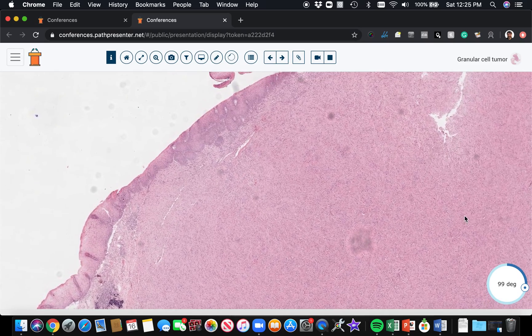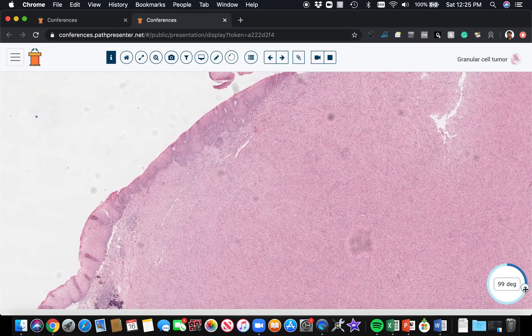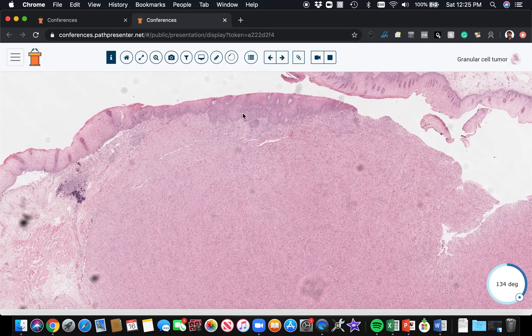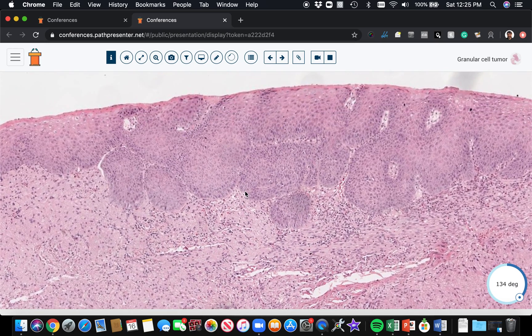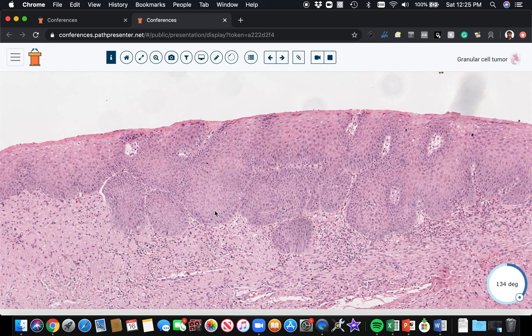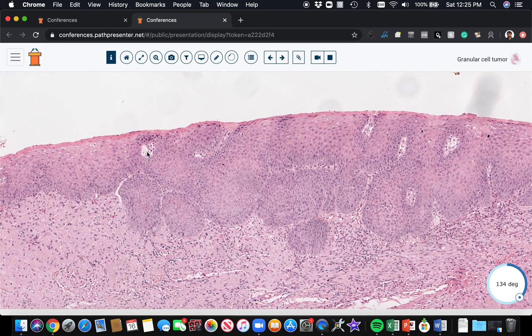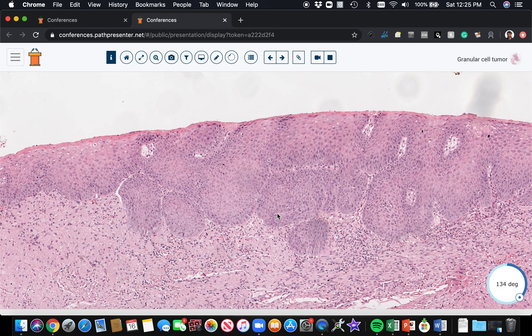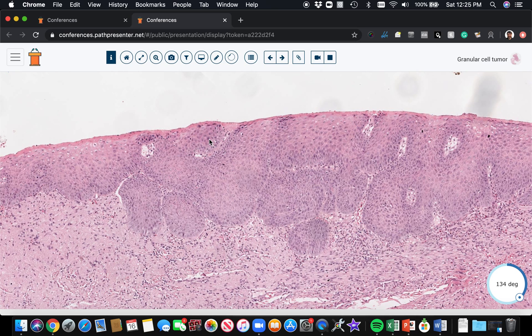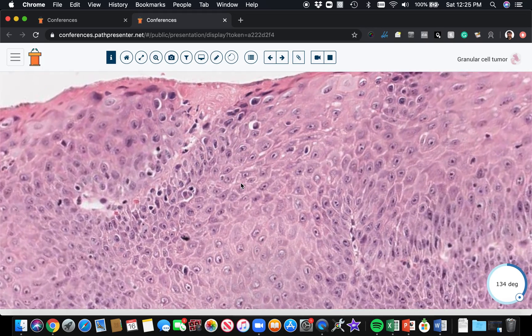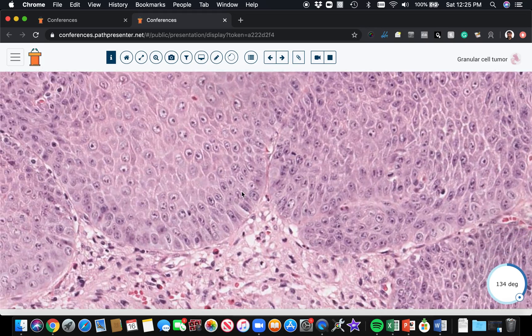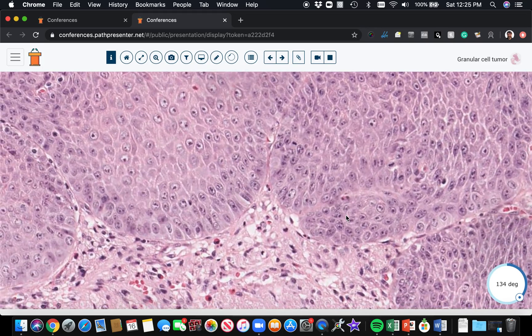The reason that's important is there's something that granular cell tumor tends to do. It tends to make the epidermis or the mucosa over top of it grow. And sometimes this growth can be really dramatically infiltrative looking. It can look malignant in what we call pseudoepitheliomatous hyperplasia. The granular cell tumor can cause the mucosa or epidermis to grow in a way that makes it get misdiagnosed as squamous cell carcinoma.